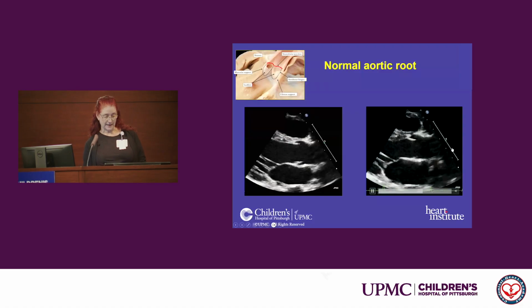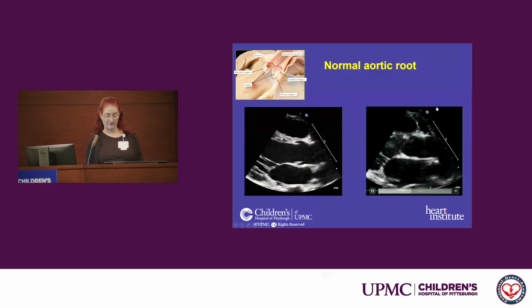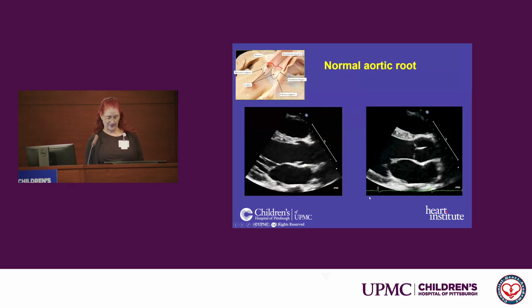And we'll just let that play. So again, aortic valve leaflets, what we in the echo world would call the annulus, the sinuses, sinotubular ridge, mitral valve, muscular portion below the aortic valve, and then the fibrous portion.